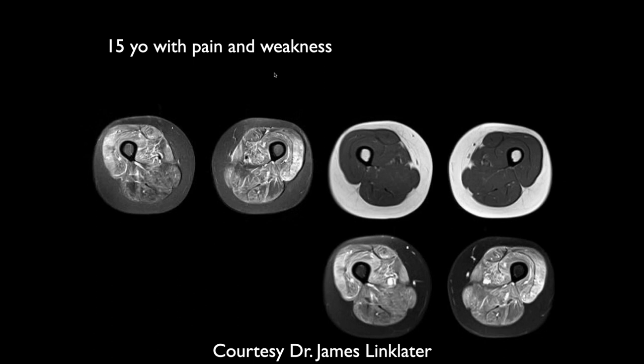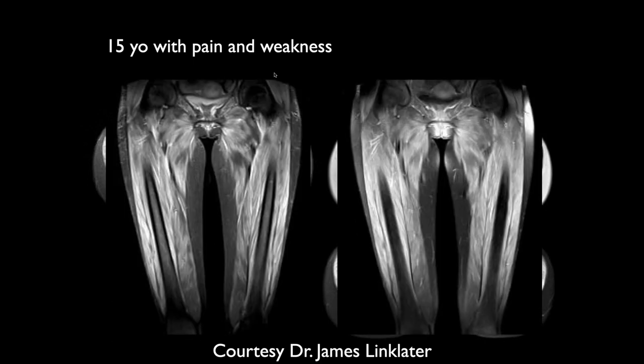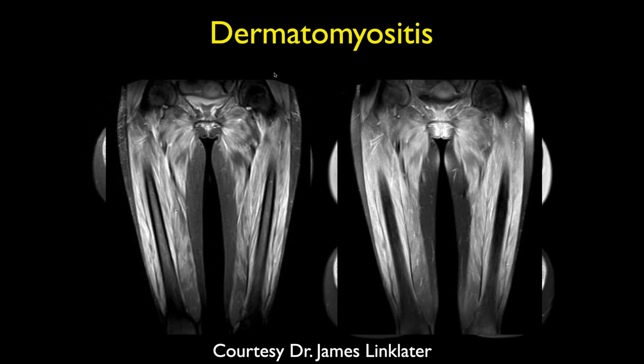So here we can see similar diffuse edema within the proximal thigh musculature, kind of symmetrically. And it looks like there's no significant fatty atrophy, but it looks like there may be some enhancement on the post-contrast images. This can also be seen with dermatomyositis.